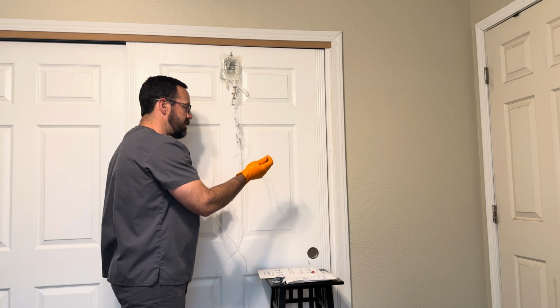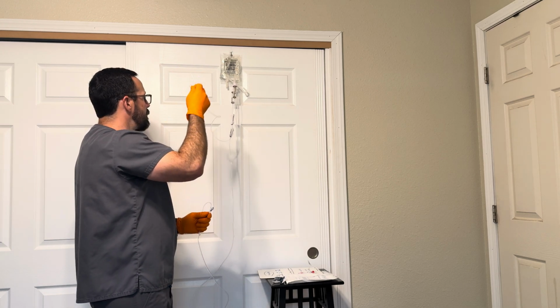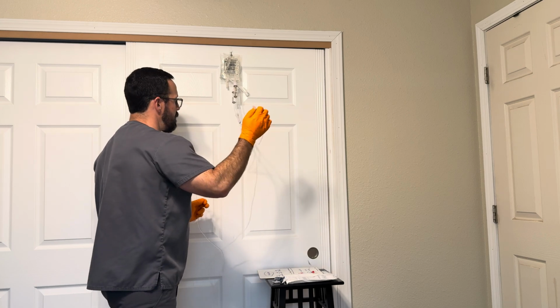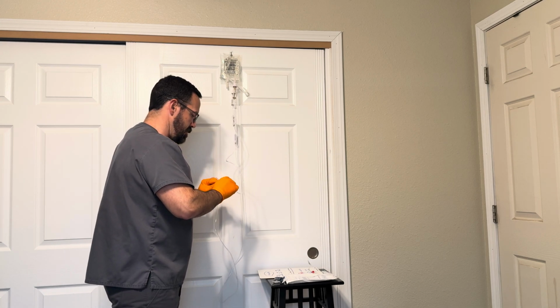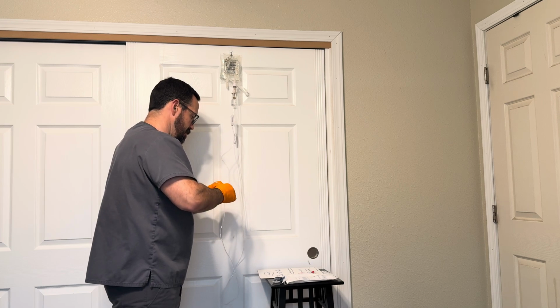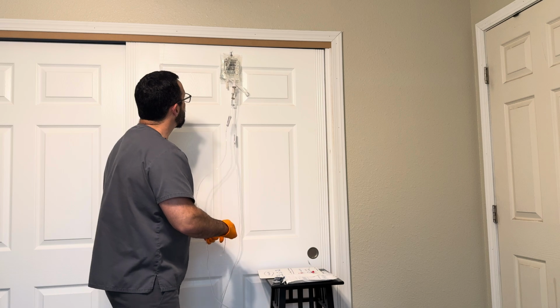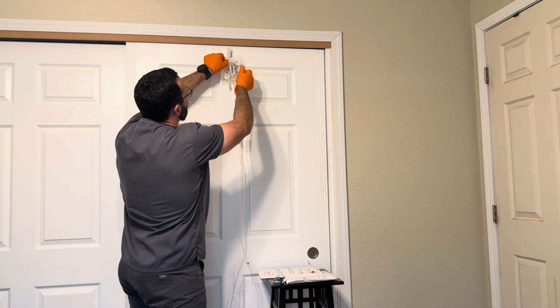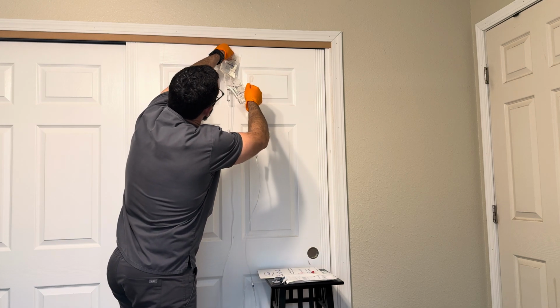So I'm going to go ahead and connect my IV, make sure I have the right one, to my white port. And then my piggyback needs to be higher than my IV solution.